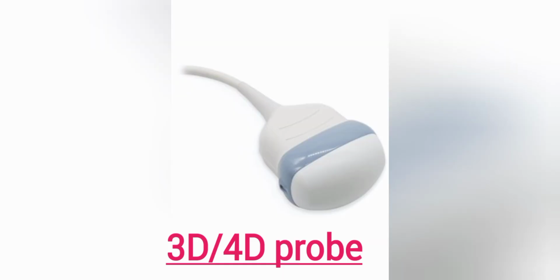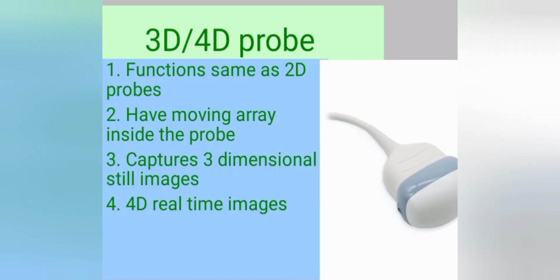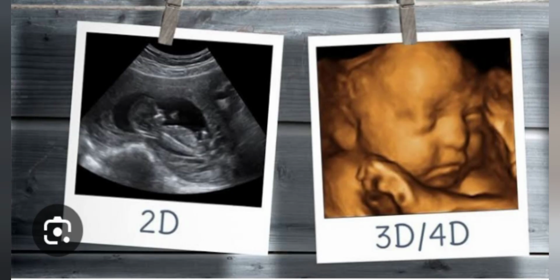Fifth is 3D 4D probes. 3D probes function same as 2D probes with exceptions of moving array. These probes have moving array inside the probe in sweeping motion and capture slices of images from different angles. These slices are then all put together to form 3D still images, and 4D probes form images in 4 dimensions to produce 4D live image, that is real time.